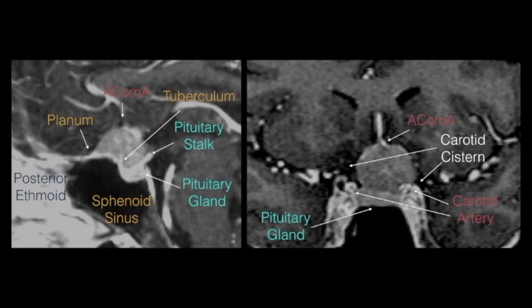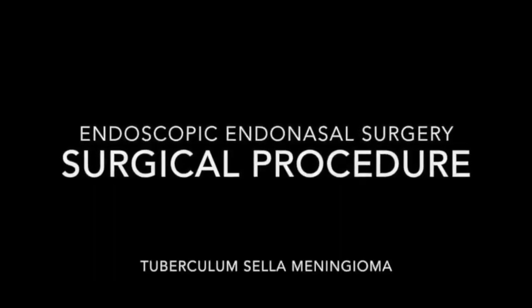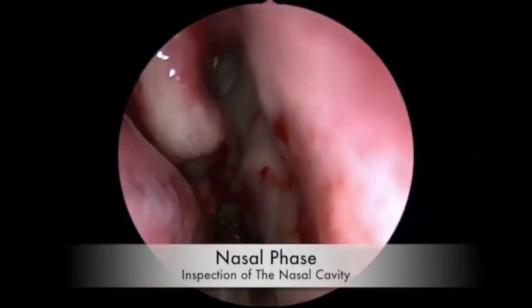Although it touches the anterior communicating artery, we will be able to dissect an arachnoid plane between the tumor and the ACOM, which should not pose a problem with the proper instrumentation and the proper large opening. That opening will have to extend from midway through the planum down into the top of the sella in order to remove the entire tumor, and from medial OCR to medial OCR.